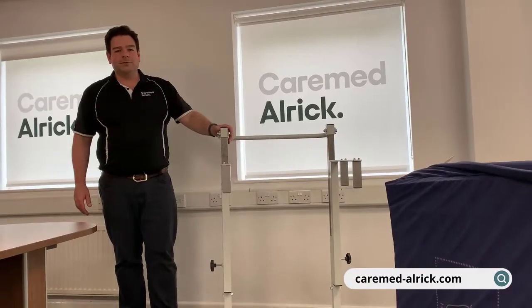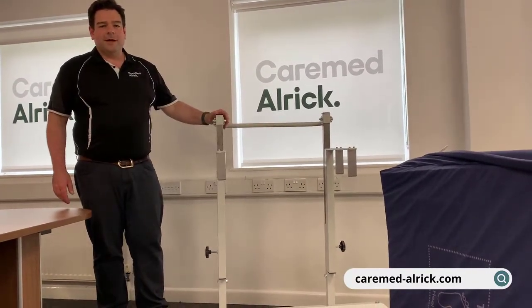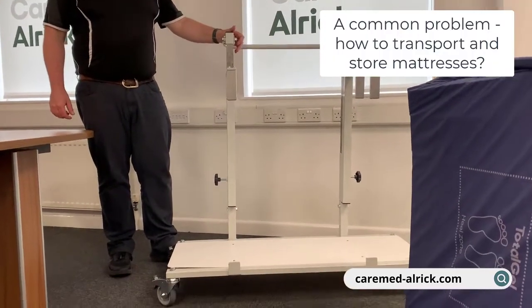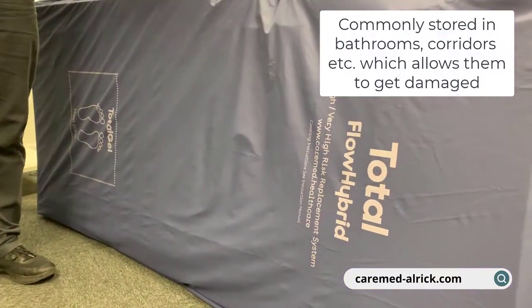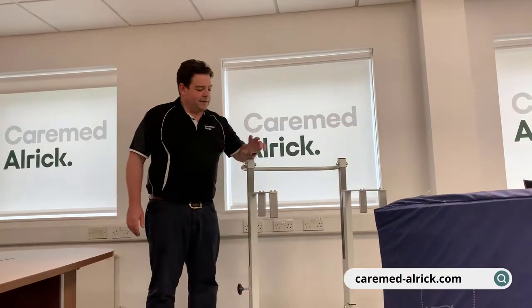A simple solution to a common problem. As we go around hospitals, care homes, and all sorts of other care settings, quite often we spot mattresses in bathrooms, mattresses in corridors. They get dirty, they get damaged, covers have to be thrown away — it costs money and it's not hygienic.